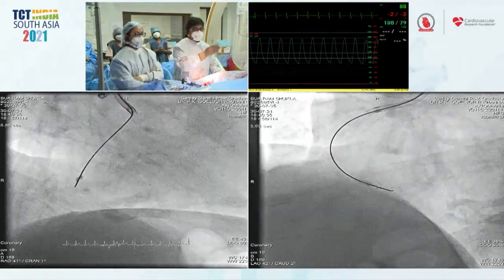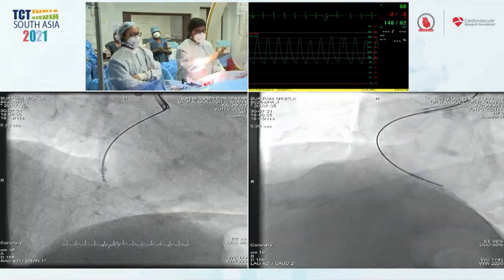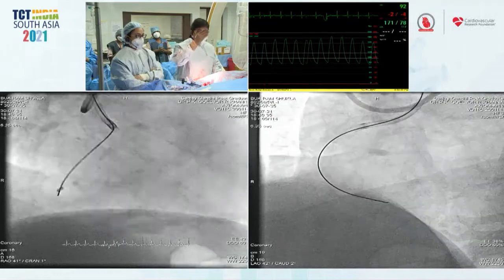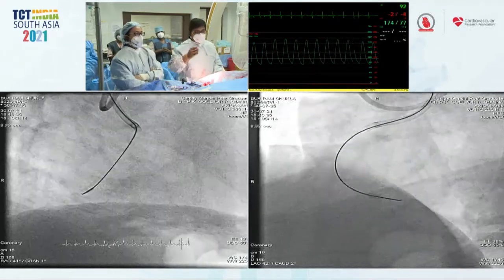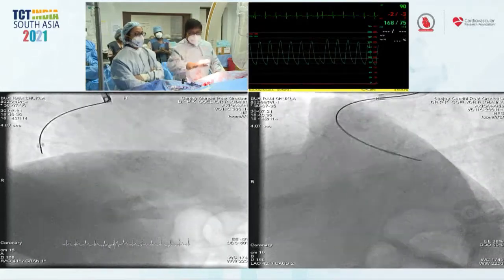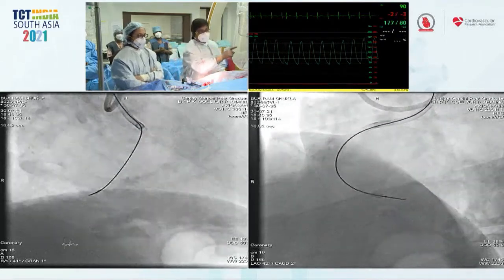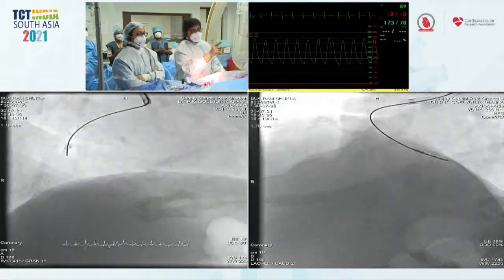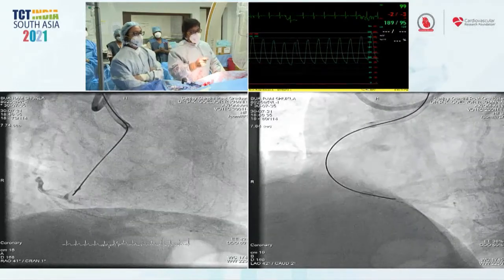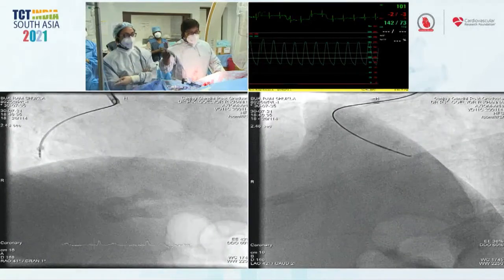That means it is in profile in RAO, and it is end face in LAO. We want the view in which it is flat, so that the artery is on one side and the balloon is on the other side. In this LAO view, the balloon is so flat that it is overlapping the artery, so you can't make out where it is. But in the RAO, the artery is on the left of the balloon. The distal artery is on the left of the balloon in RAO view. So what I need to do is to push my Stingray wire onto the left side in RAO view. That is exactly what I did.